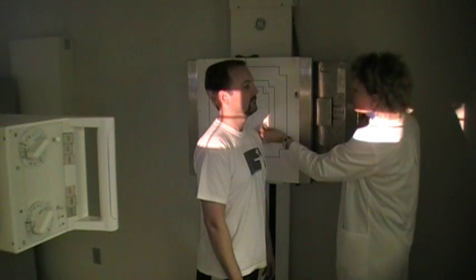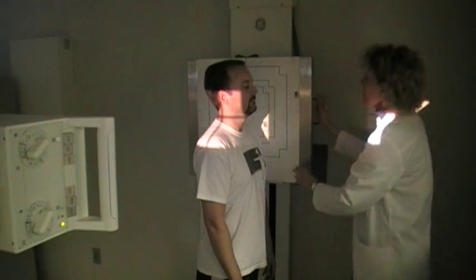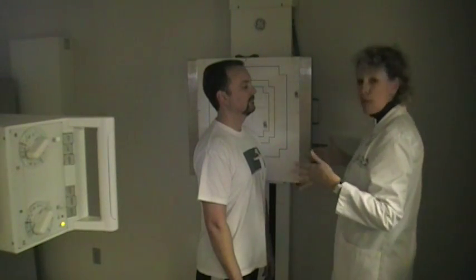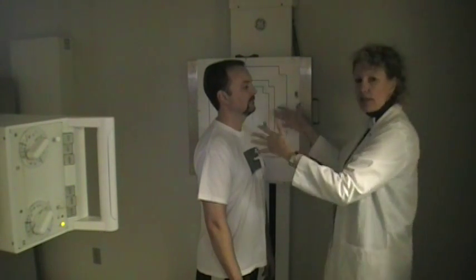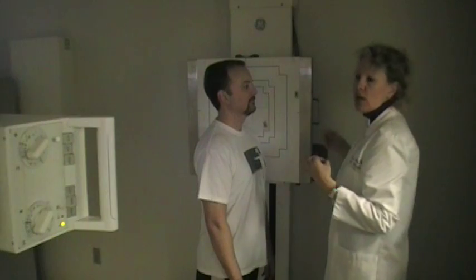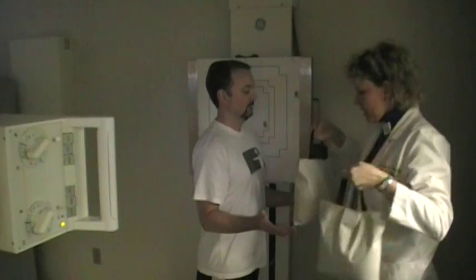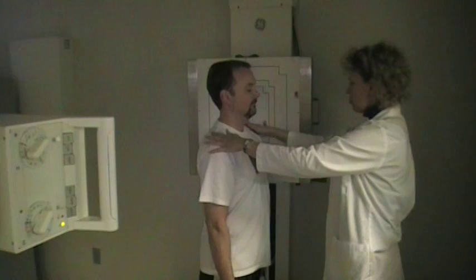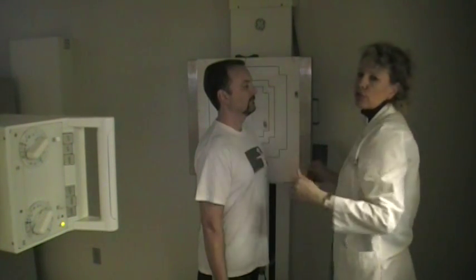Put your left marker on here since his left shoulder is touching up against the board. Make sure the shoulders are relaxed. The patient is standing evenly on both legs facing towards you. Now oftentimes with men, because they do have stockier shoulders, you may want to have them hold some weights. Now I'm going to give David some weights here to hold, and put your arms down by your side, and that should pull the shoulders down even more so that we can see hopefully all 7 of the cervical vertebrae and the top of T1.